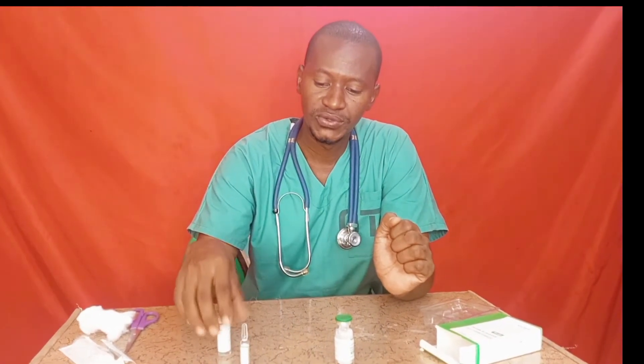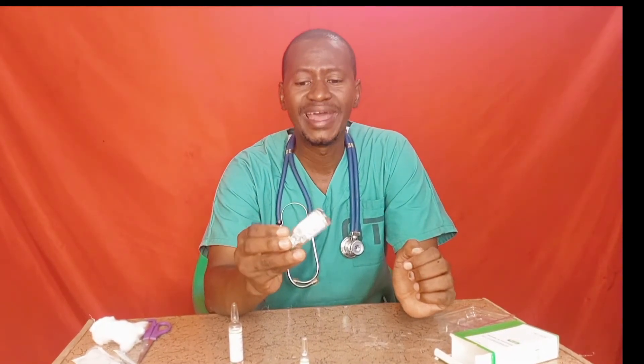To dilute the drug safely and effectively, first get the vial of the drug, then add the 2 ml of sodium bicarbonate into the vial and start shaking it gently. Do not add the sodium chloride before the solution becomes clear, because it will not be effective for treating severe malaria.